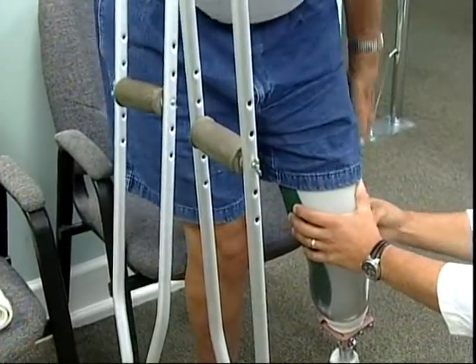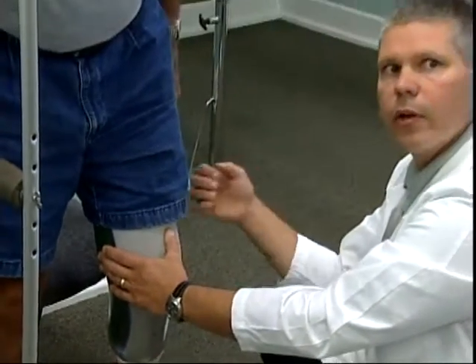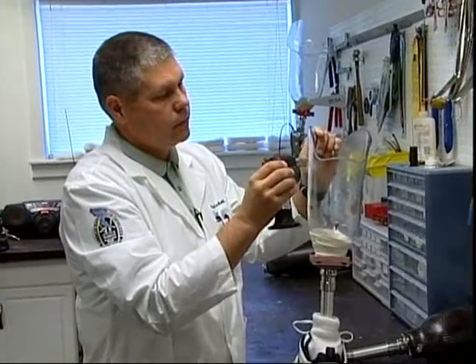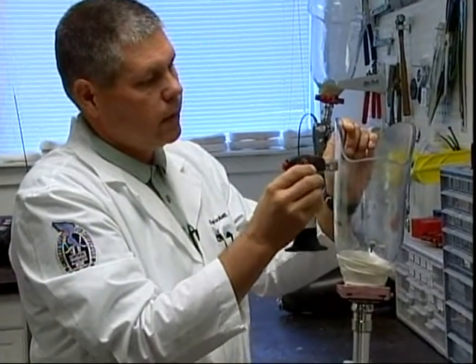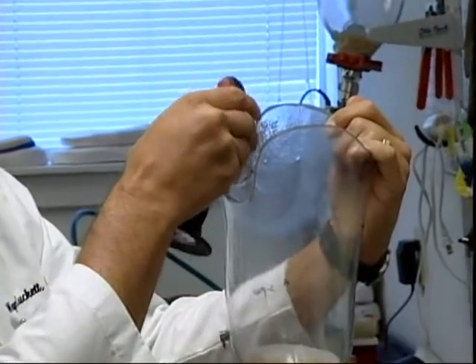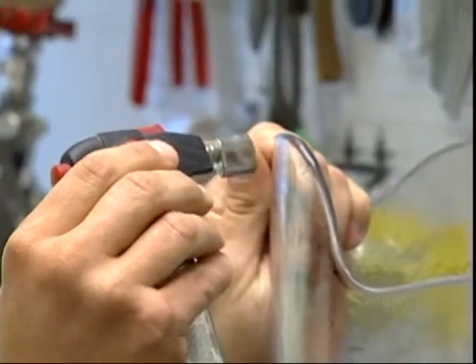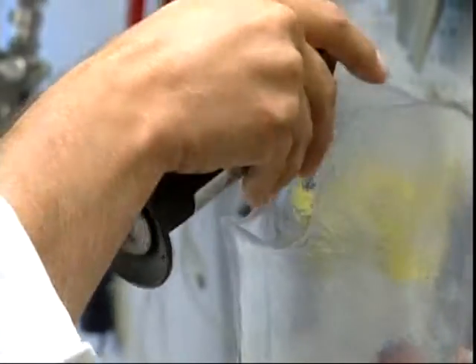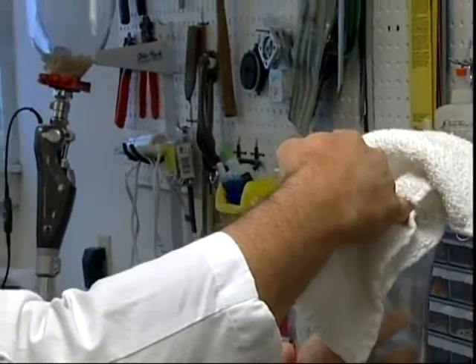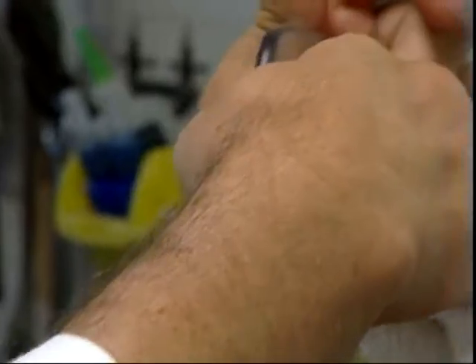Might need to be turned out a little bit. What he's feeling is there's a little bit of pressure on his lateral condyle here. So I'm going to take this plastic device, put some heat to it, flare that out just a little bit, and improve that comfort in that region before we finish this up. We had just a little too much bony contact right here. We heat this plastic with a blowtorch, soften it up a little bit, and then we just move it with a towel. You can see how that flexes out. It cools rather quickly.